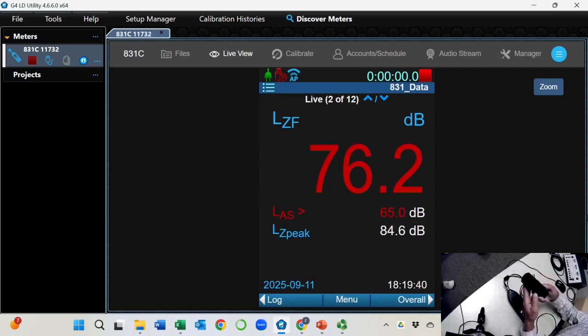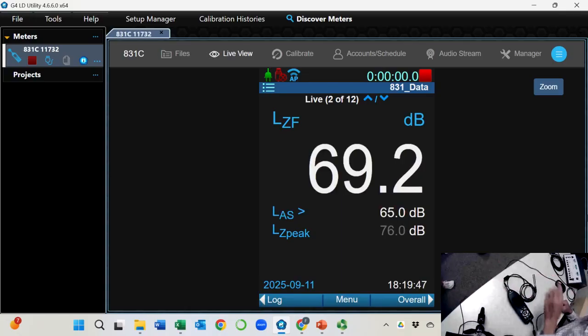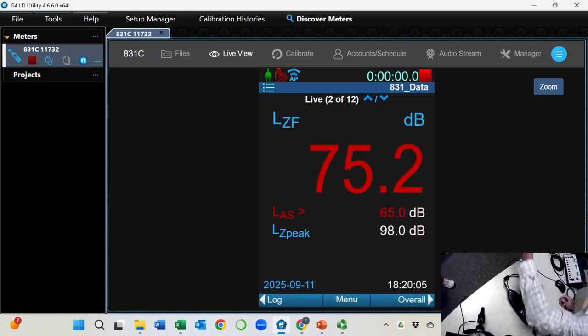When I press the button, there's a button here. Can you pass it along? Bree will confirm it's 114 dB SPL, right, Bree? And Sammy will confirm it's 250 Hertz, right? The reason I'm asking is, don't ask me how to calibrate this calibrator.